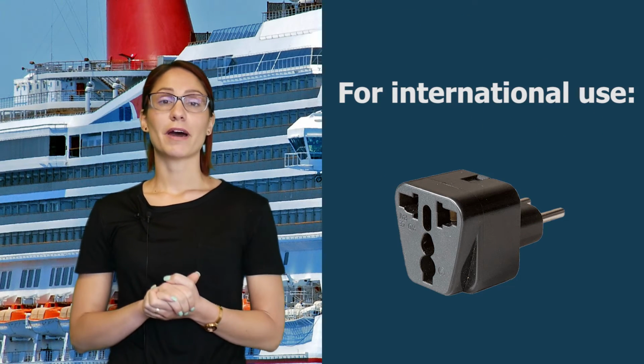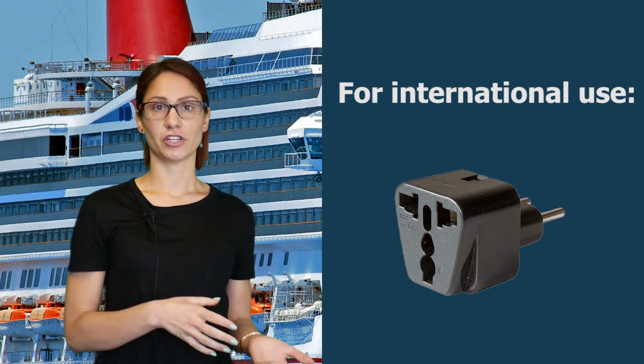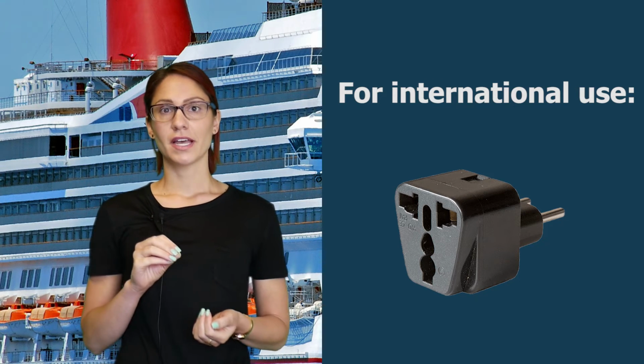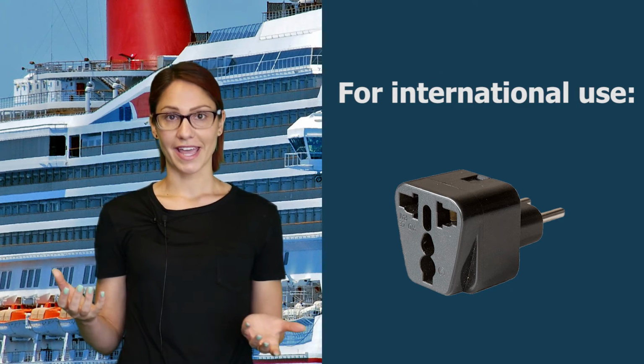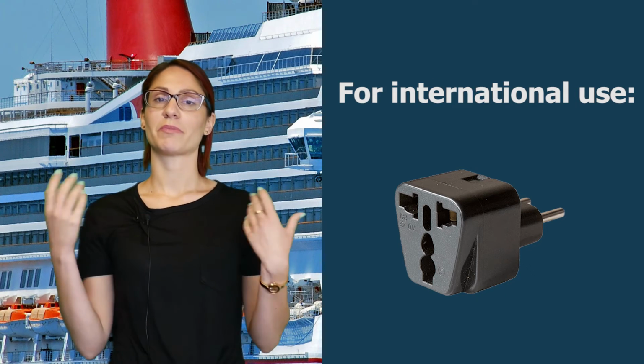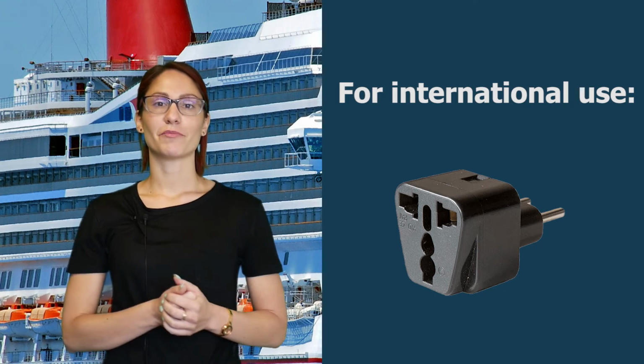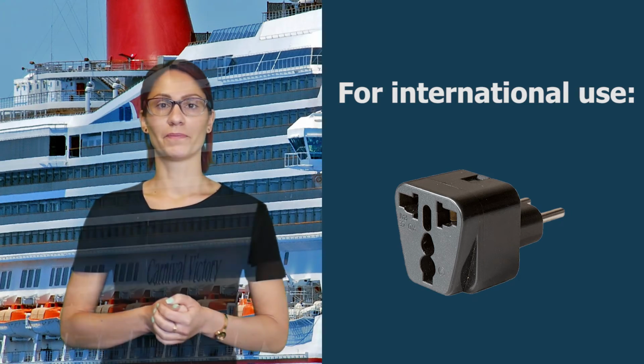So another thing to think about is if you are cruising internationally, make sure that, again, you do have that prong adapter that's going to fit with the country that you're in. You don't need a converter because remember, these machines do 110 volt up to 240, but you will need a different prong so that you can plug into the wall.